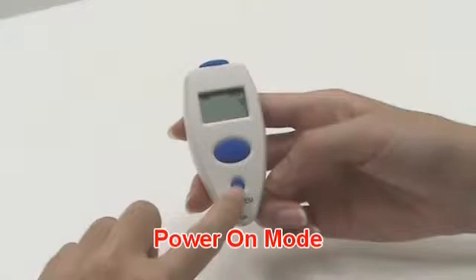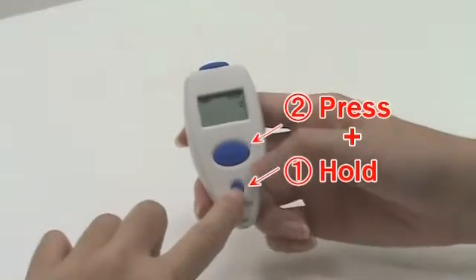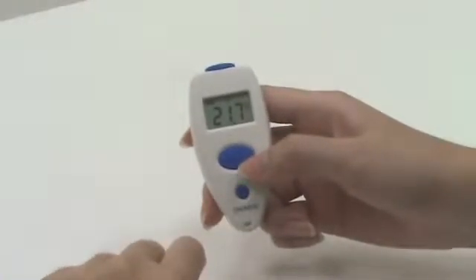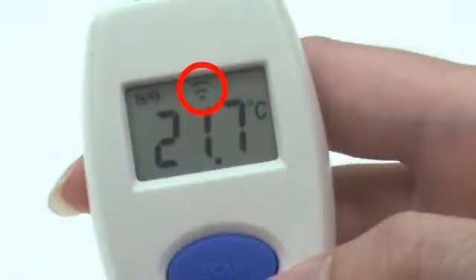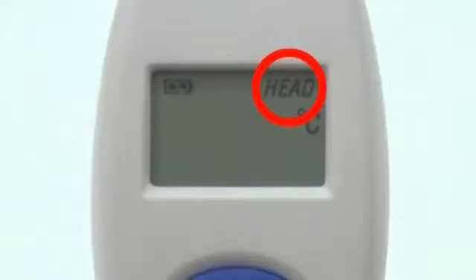In power-on mode, press and hold the memory button, then press the scan button. The head icon will be switched to the scan icon. You may also use the same process to change back from scan function to forehead function.